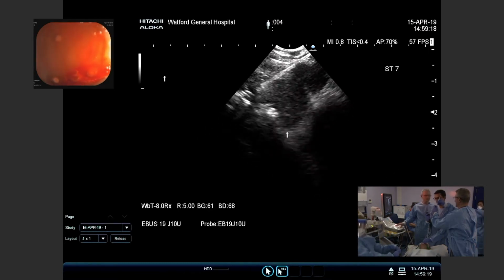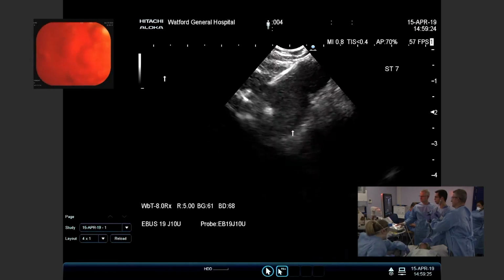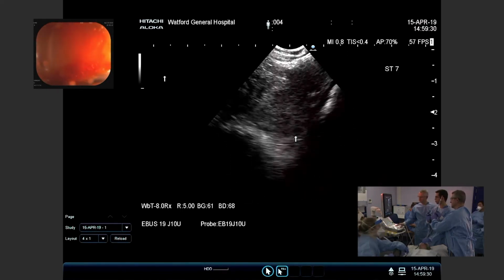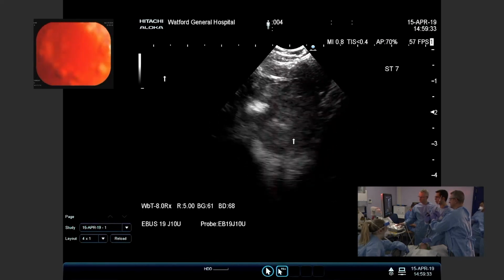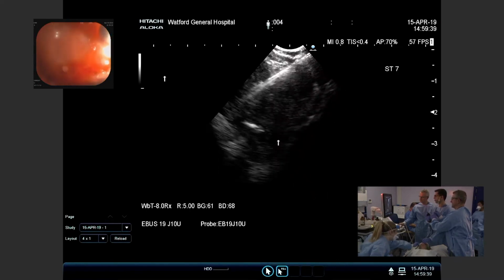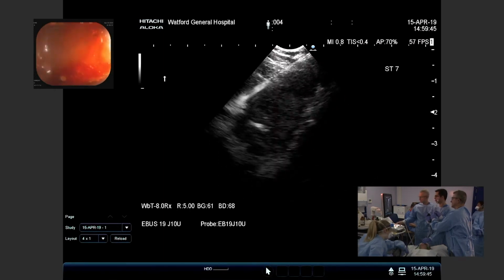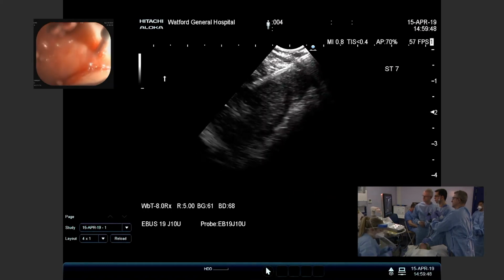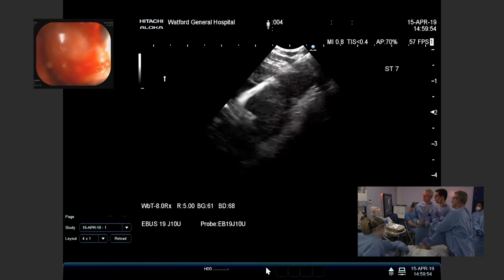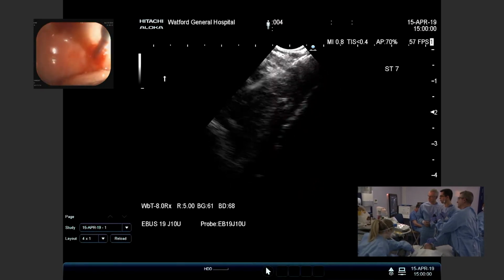So that first pass was mainly blood. Okay, I haven't seen pass 2 yet. So this is pass 3. Rahul, if I hover superficially, could you just put some tip down, so thumb down? Thumb down, okay. So you've got a completely different angle now. Just trying to get to a slightly different place. Okay. I think that's it, it's mainly blood. This is nice technique, going back and forth.